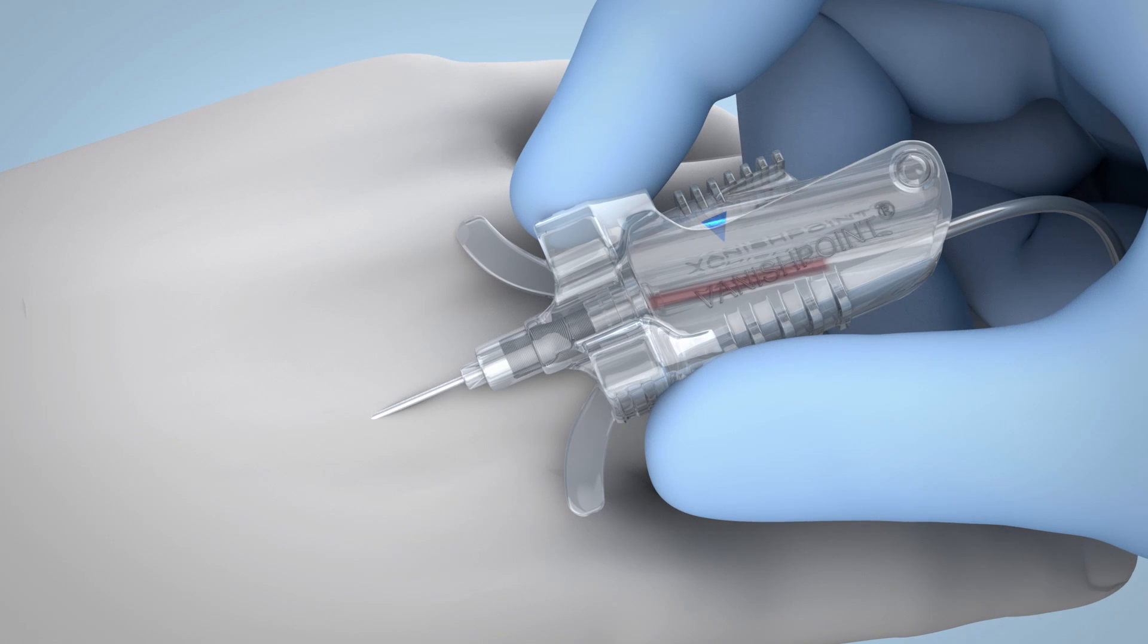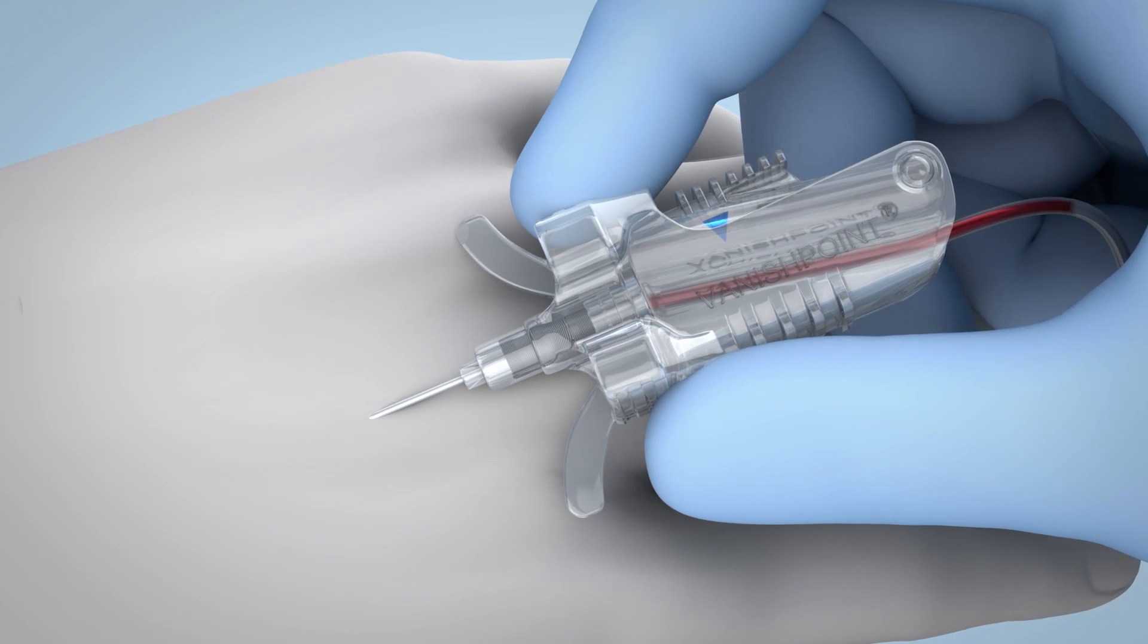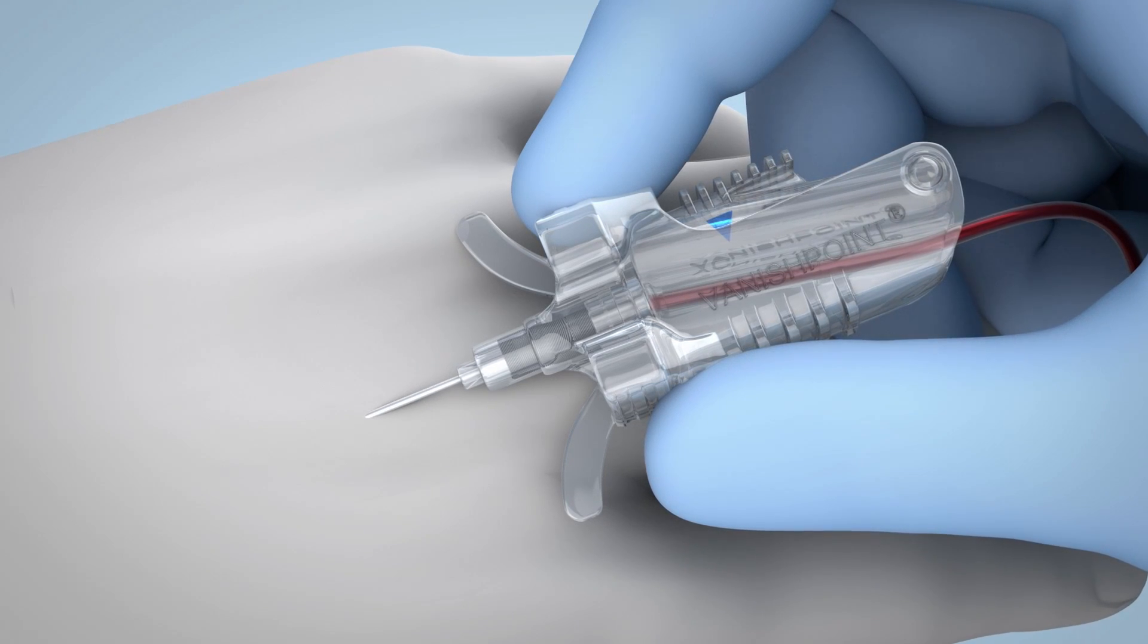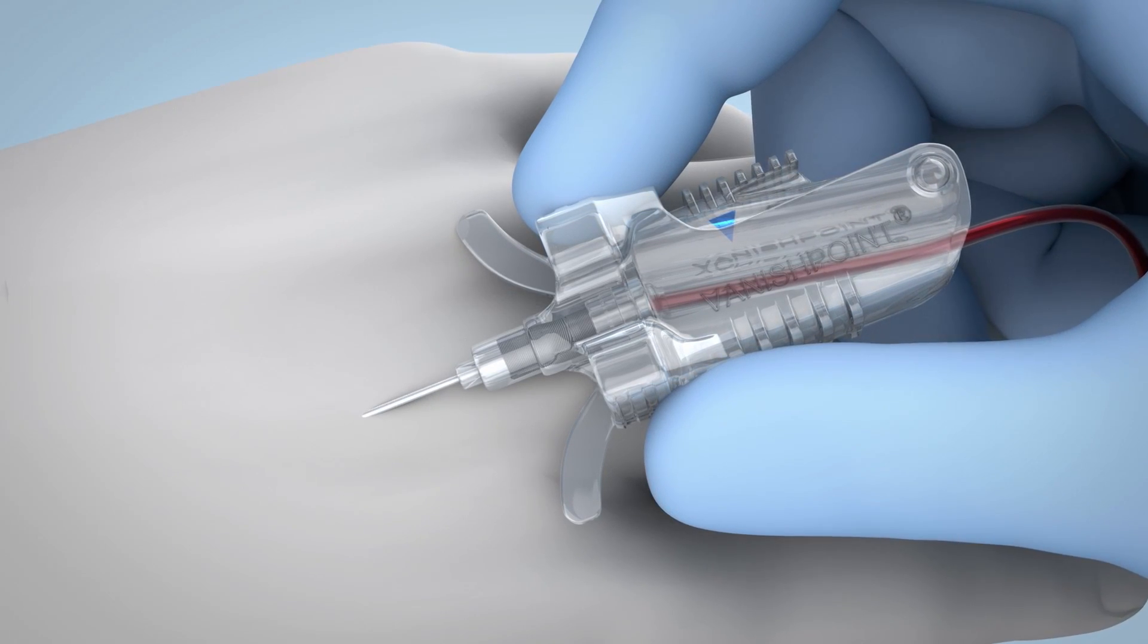Perform the venipuncture, observing for blood return. The Vanishpoint Blood Collection Set's clear body allows for easy flashback visualization.